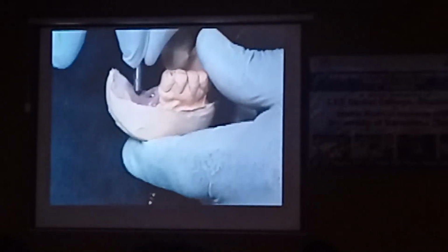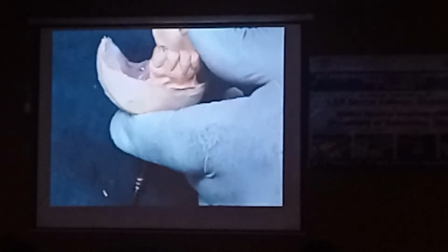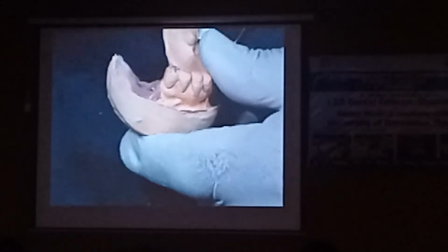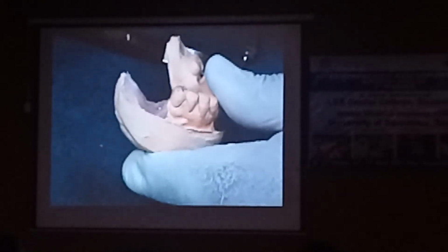Otherwise, individually, both will see. So if I am making 2 individual crowns, I don't have to do the splinting part. But if I am planning to splint the crowns, then only I have to go through the cycle of splinting and everything, right? The purpose of the splint is to record the correct inter-implant relationship, right?